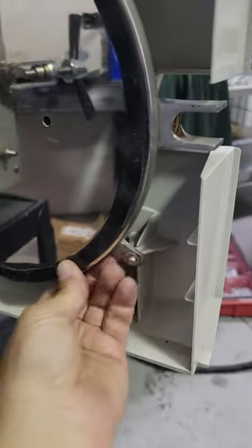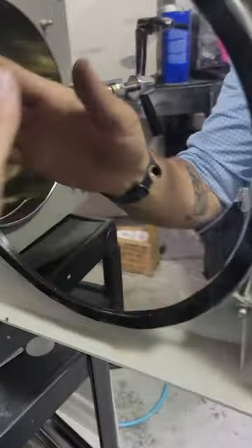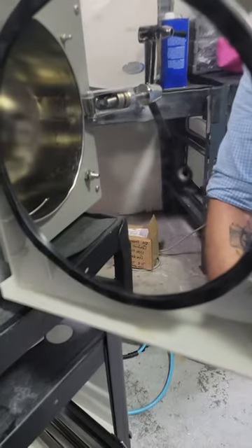Bada bing, bada boom. Now you can just go around — that's the easy part. There you go. The door gasket will change shape when you close the door; it'll tighten a little bit, but it'll smooth out. Good to go.